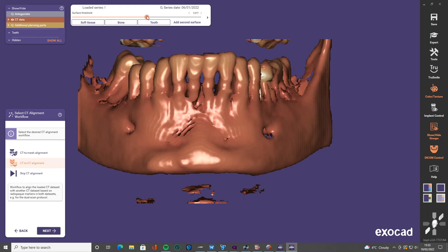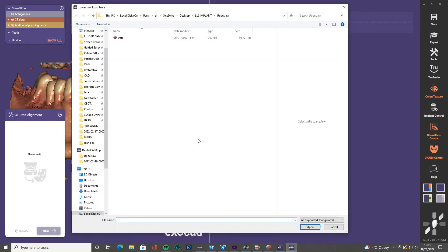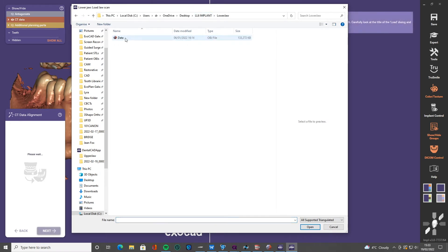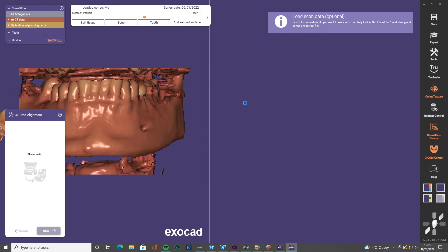And here in this stage, we just click CT to mesh alignment, we're going to be using a scan, we're not going to be doing anything fancy like all on four and aligning two DICOMs. Just going to go simple, conventional and you're going to see how beautifully it aligns this data.